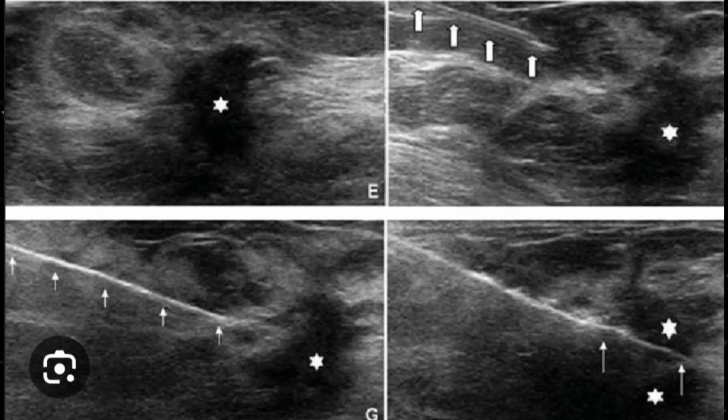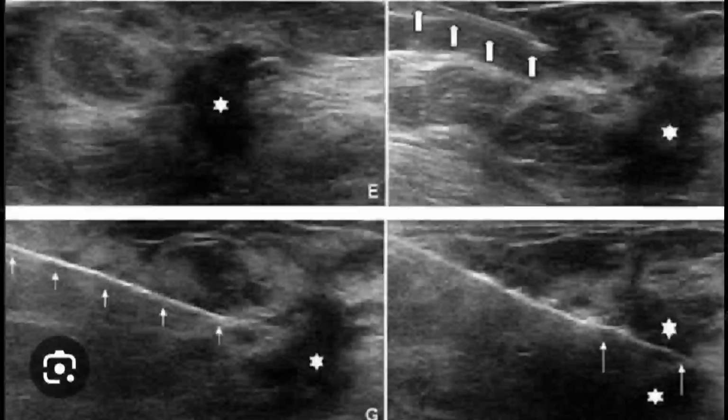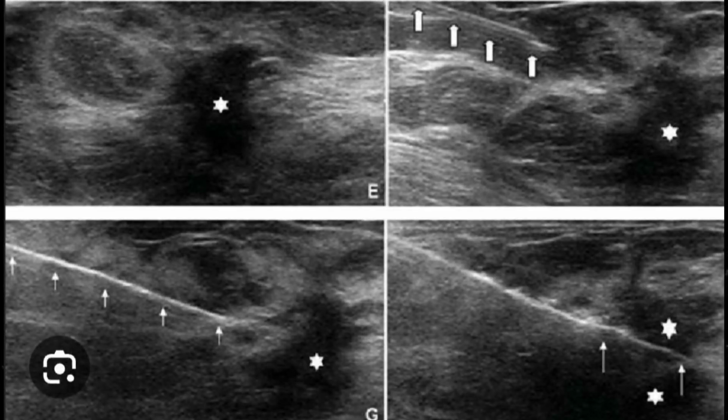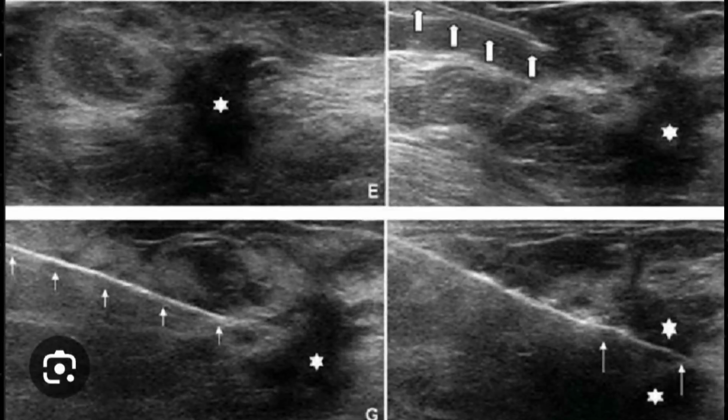In this image you can appreciate that there is a lesion, and under the guidance of ultrasound imaging, the needle has been placed inside and is gradually approaching the targeted lesion. In the second image the needle is halfway between the skin and the lesion, in the third image it is nearly touching the lesion, and in the fourth image the needle is exactly placed within the lesion.